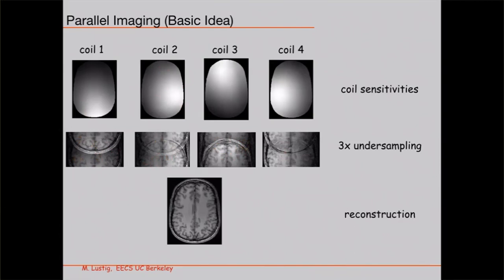And if I actually stare at this image, this point almost doesn't appear as if it has aliasing whatsoever, right? I could have cropped this part of the image and deleted this, and that looks pretty good. And I could do the same thing here. And that looks like the front of the head, but they're still corrupted. There's still a line over here.